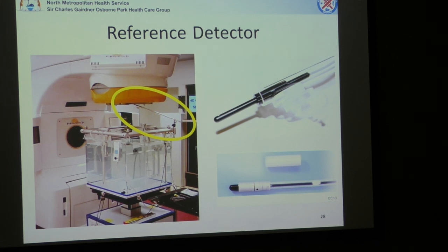And the final kind of detector. We measure profiles in a water tank, so you'll often see this extra detector coming up here, and it looks like this. We divide the signal here by the signal here, because the beam output varies over time. If your beam output goes up, you account for it because you're measuring it here. So it's accounting for variations.